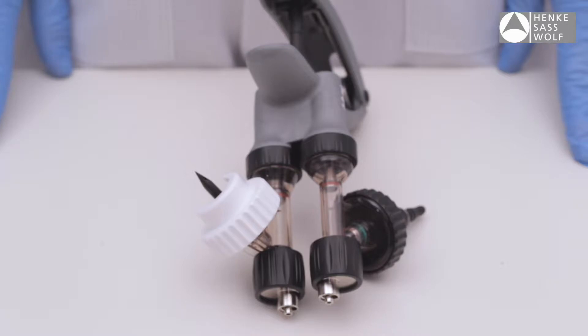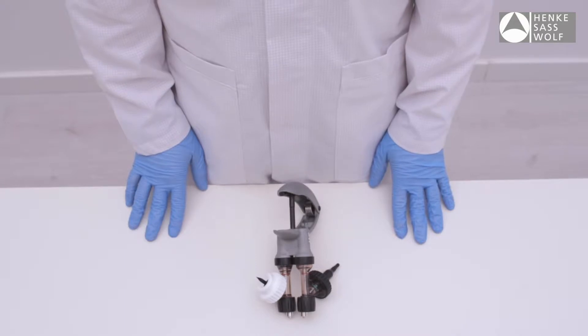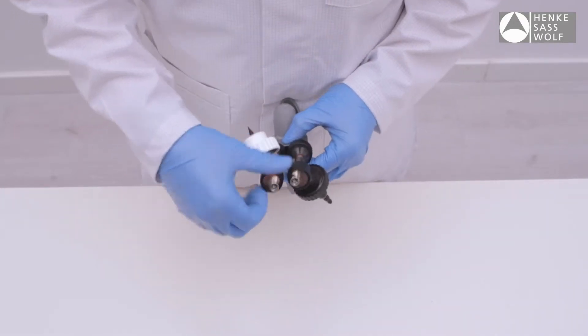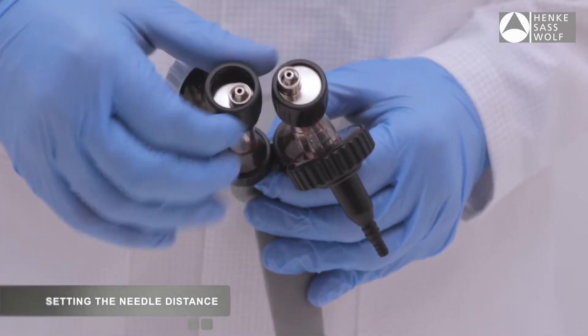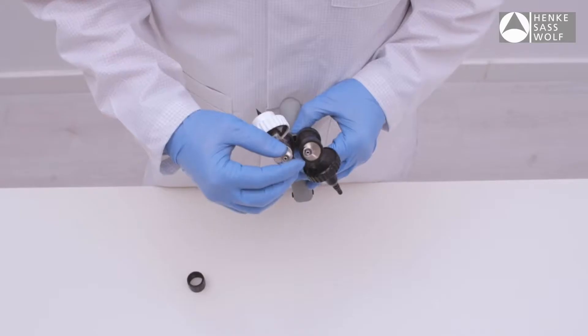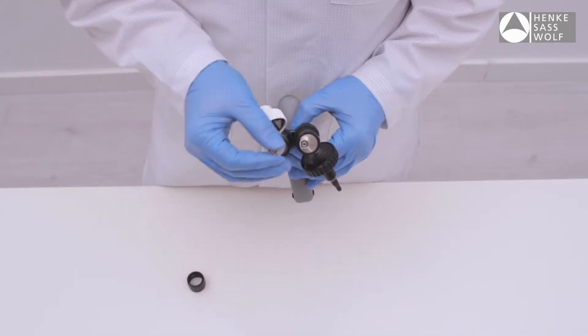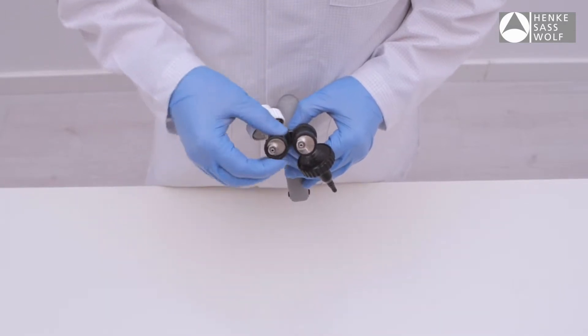The needle distance can be changed based on the age, size, and type of animal. There are seven needle distance settings between 20 mm and 36 mm possible. Loosen the needle nut, take it off, and position the metal needle fitting in one of the seven positions, then tighten the needle nut.